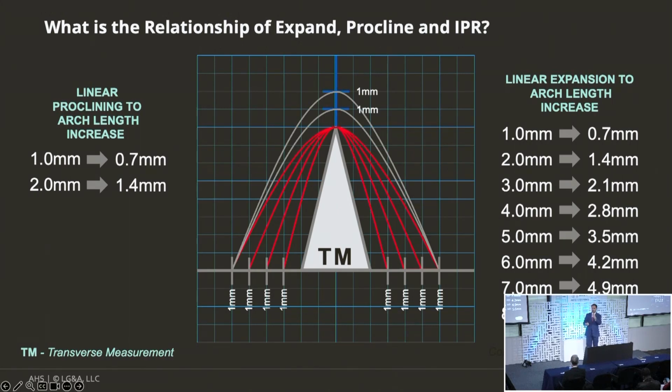Now, the one category where I'll throw a piece in is going to be the black triangle. When someone smiles and I see a poppy seed, I put 0.1, just like any other normal person. You put 0.1 because you make a little change. It gives you the papilla filled in. That's a nice service. That's an aesthetic. We're talking about losing 0.5s between teeth, okay? That's a technique that is a choice you could do, or you can study this map a little bit and see how easy it is to get rid of IPR.